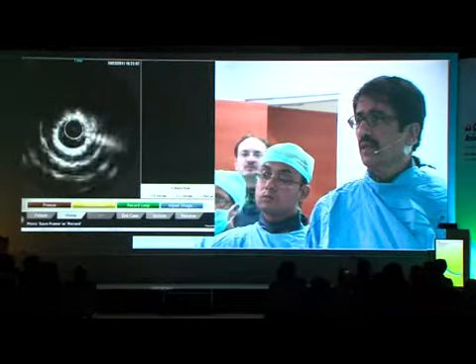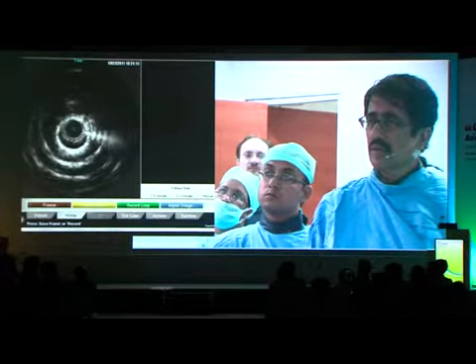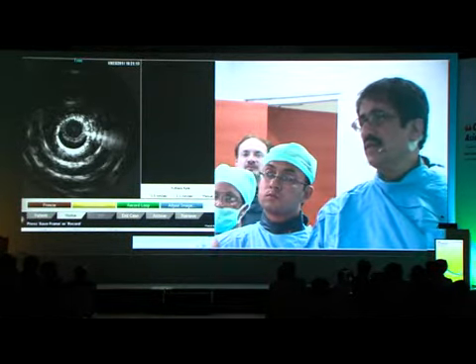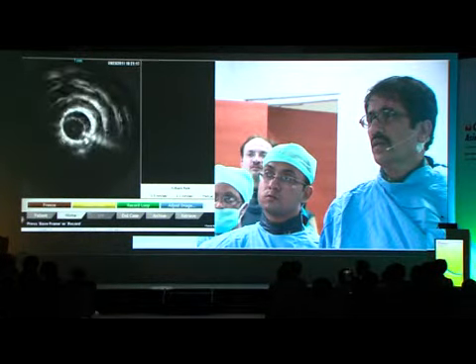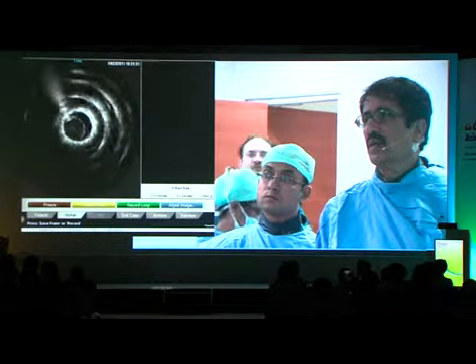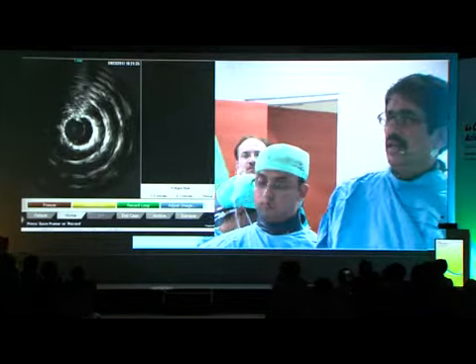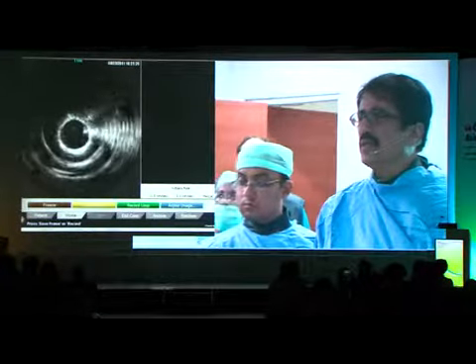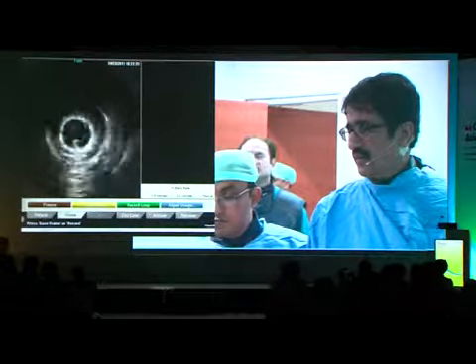What is underexpanded? Just after the diagonal, the LAD stent appears to be underexpanded. Make it a little forward, backward. Just immediately to the diagonal, there is some. I think it's pretty good. So anyway, let's go on.